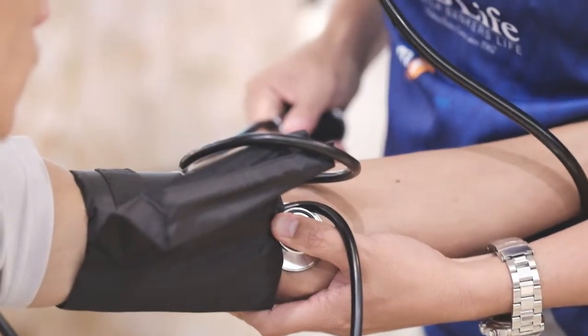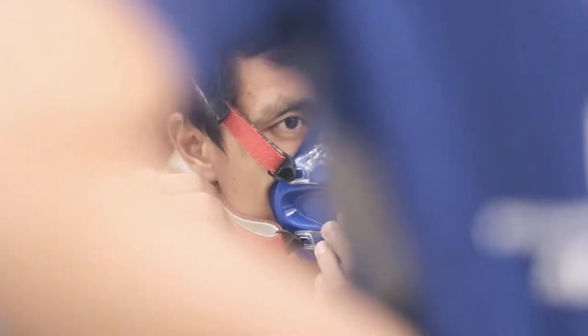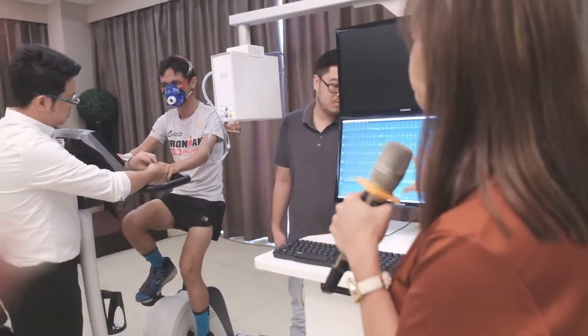So I'll be teaching you the instructions. Okay, so we have 4 steps. 4 steps consist of 1 cycle. We'll be doing about 2 to 3 cycles today so that we can compare which is your best performance of the 3.